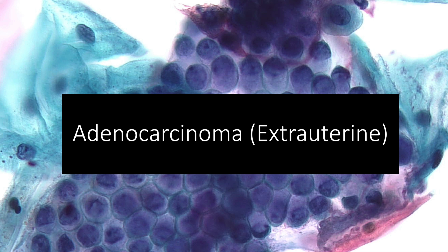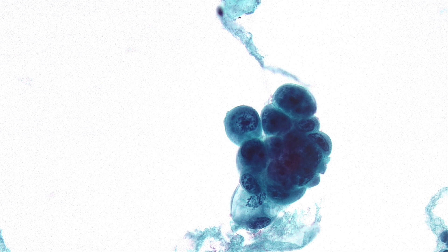Although very uncommon, one must consider extrauterine adenocarcinomas in cervical cytology specimens. This is an example of a high-grade serous carcinoma of the fallopian tube or ovary, showing rounded glandular cells with focal foamy cytoplasm and a mitotic figure. In extrauterine cases there is typically a clean background. These papillary clusters presumably came through the fallopian tube into the uterus and were sampled as part of cervical cytology — a drop metastatic disease pattern.